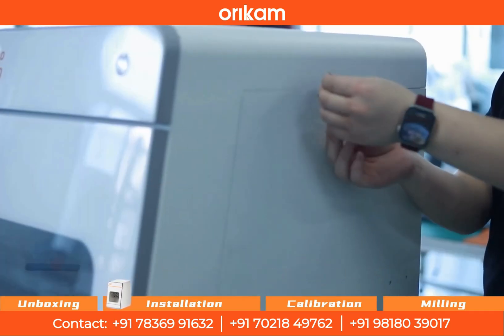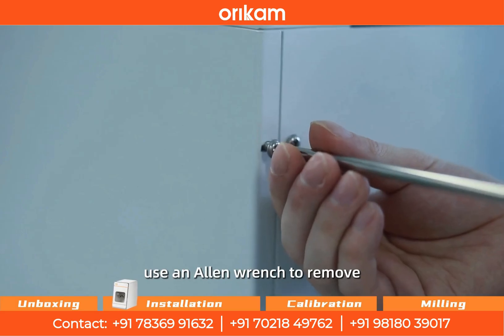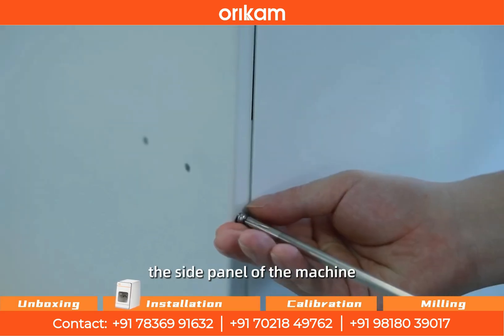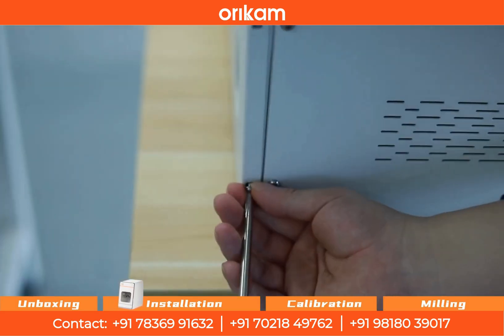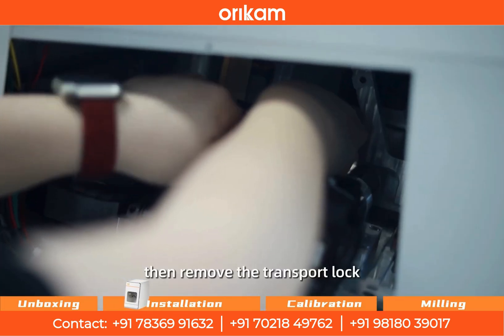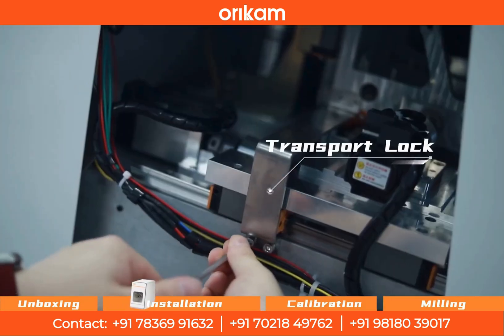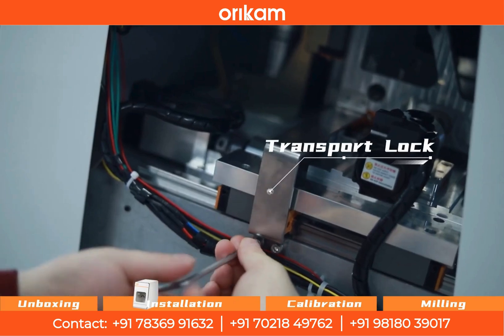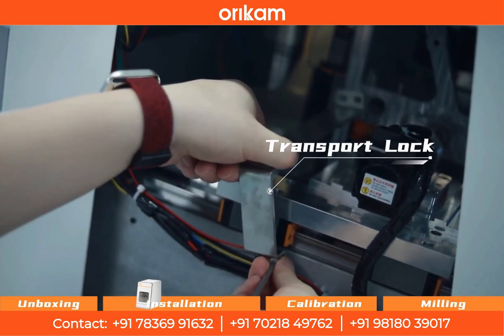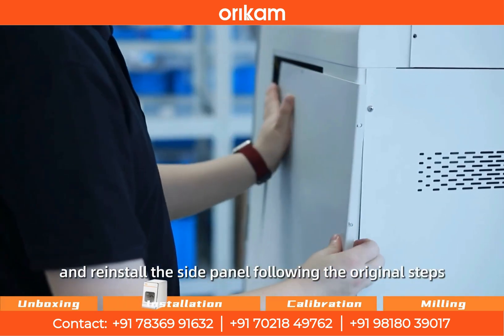Before using the machine, remove the screws at the rear of the side panel and use an allen wrench to remove the side panel of the machine. Then remove the transport lock, and reinstall the side panel following the original steps.